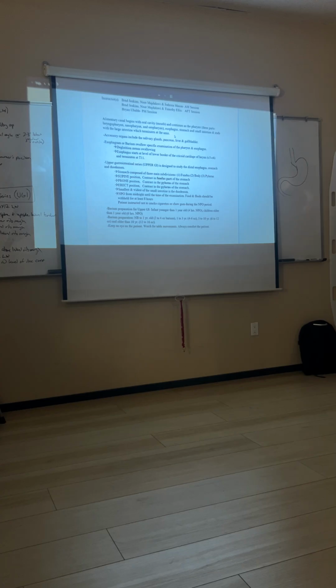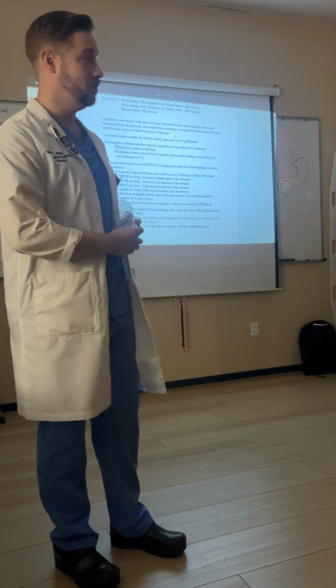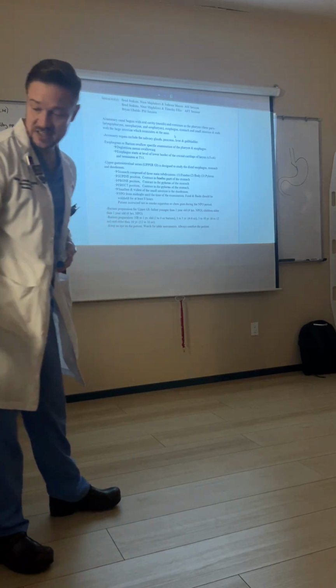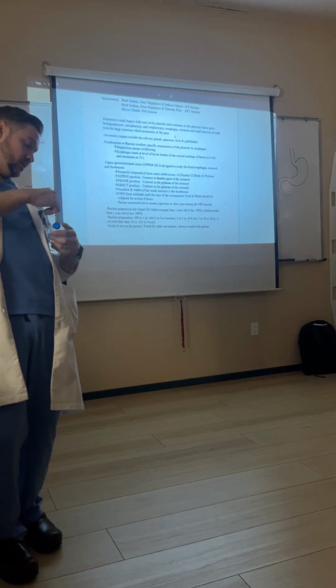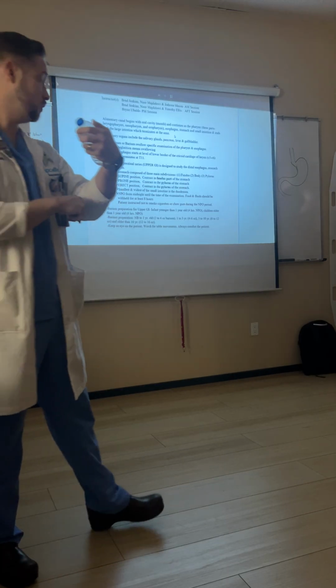Okay, so the easiest way for you to learn where contrast is in the stomach is to use a bottle and put it right here on your body, okay? So when I'm lying flat on my back, the contrast media flows into the fundus of the stomach, okay?